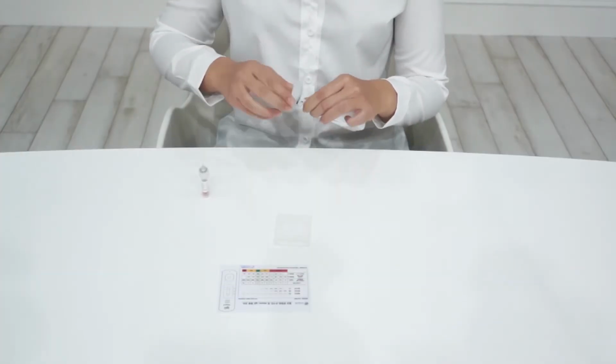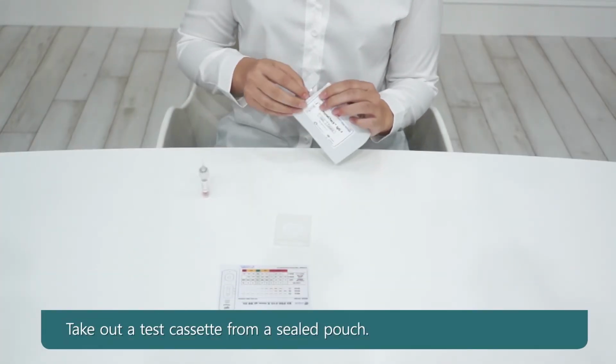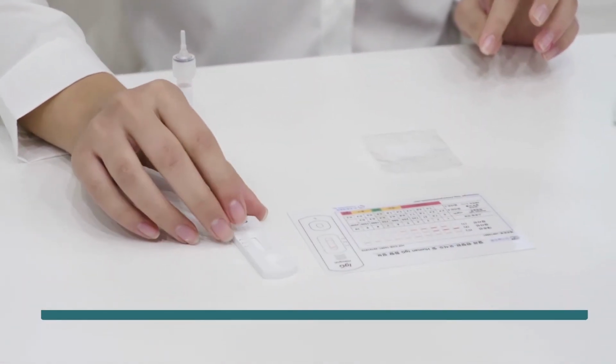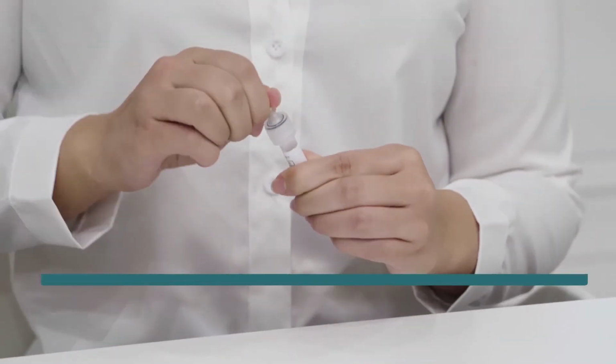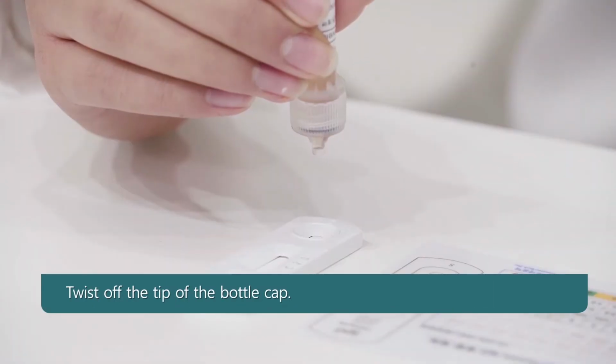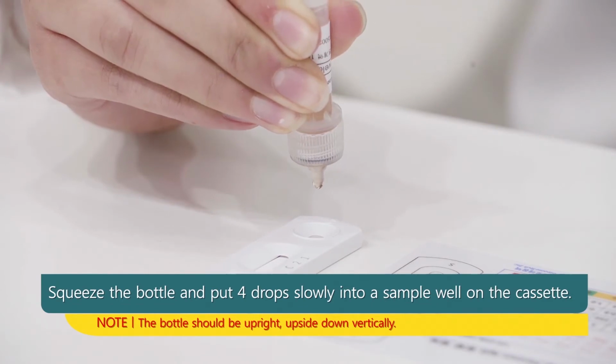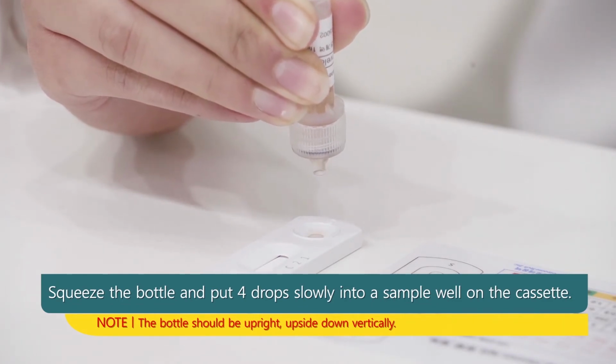Take out a test cassette from a sealed pouch. Place the test cassette on a flat surface. Twist off the tip of the bottle cap. Squeeze the bottle and put 4 drops slowly into a sample well on the cassette.